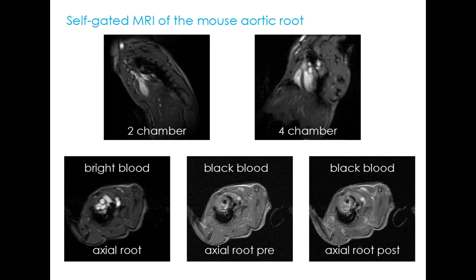And one thing that I should mention that I've not mentioned before, and this is very specific to vascular imaging, typically when we perform vascular imaging, we use so-called black blood techniques if we want to, of course, see the arterial vessel wall and not the vessel lumen. These are specific MRI techniques that null the signal from the blood pool so that the vessel wall can be easily seen.